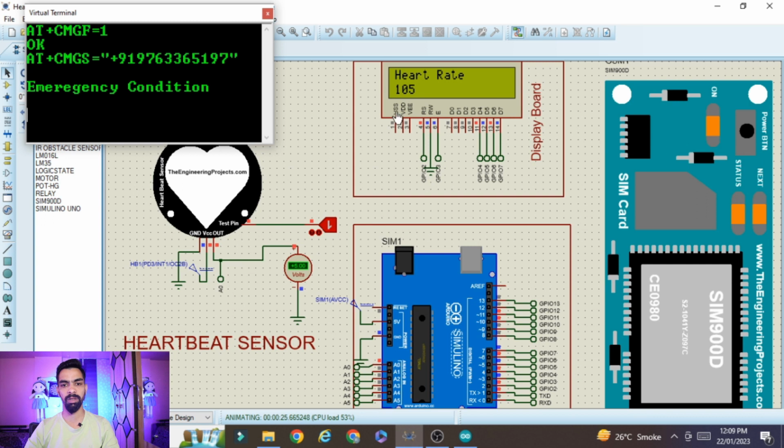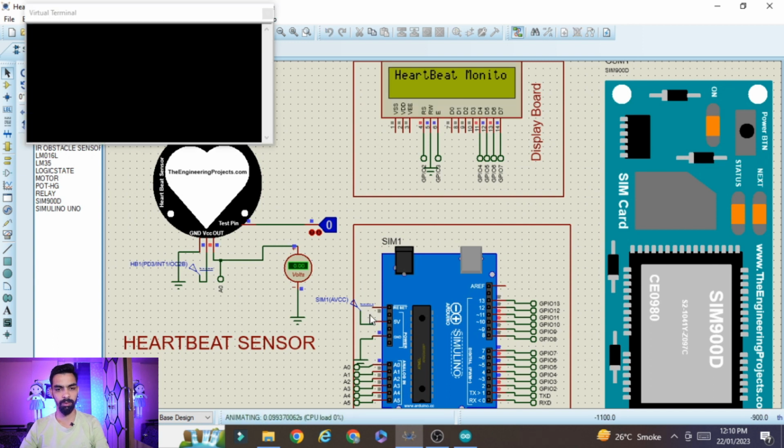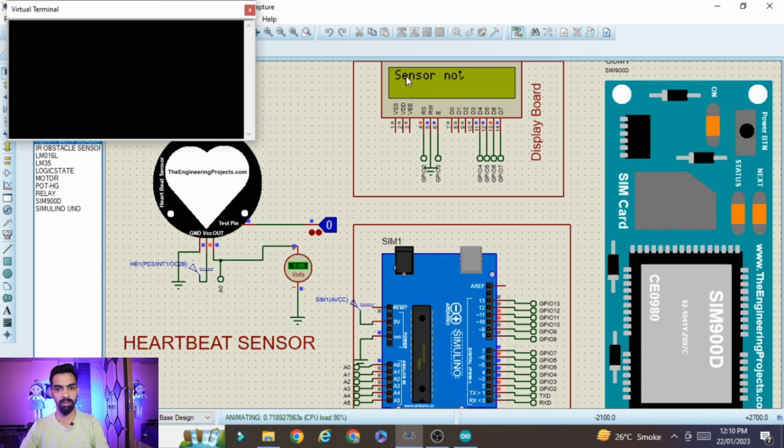Now we will see the low pulse. If the low pulse is detected also below 30, then what will happen? Now again I start the program. So you can see heartbeat sensor monitoring system project displayed on the LCD, the name displayed on the LCD. Now sensor not detected. Now we are checking the condition if the pulse is below 30.